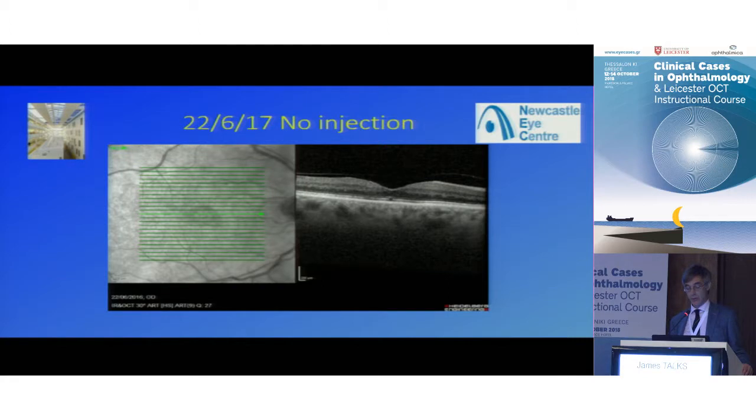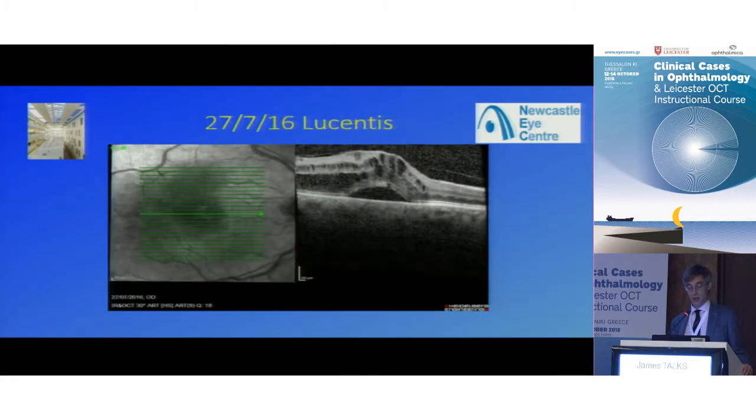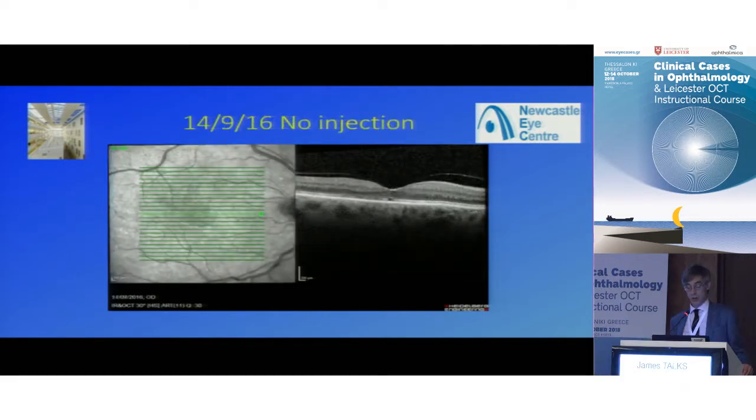So this is June 2017. July, oh, I think I've got the date wrong. This is 17. Fluid's come back again. More, and you can see it on the infrared, the shadow of where all the fluid is. And that subretinal fluid again. Treat them again. So it was 16 anyway. We've now gone a year, and we're still injecting.